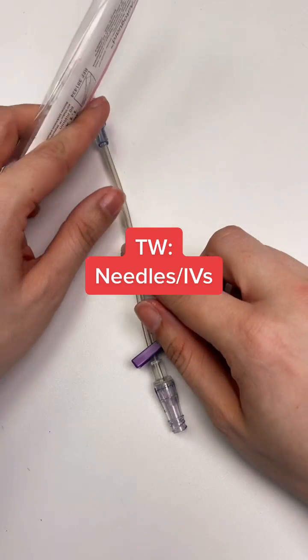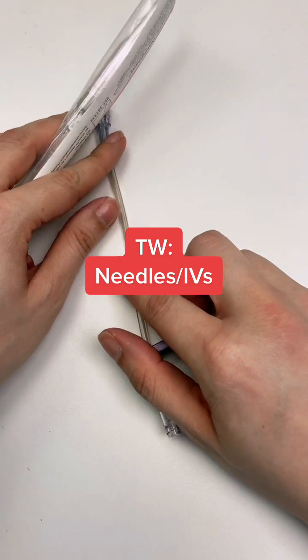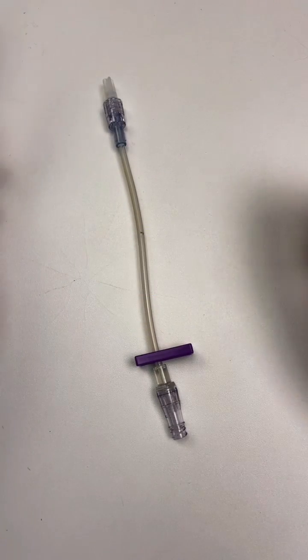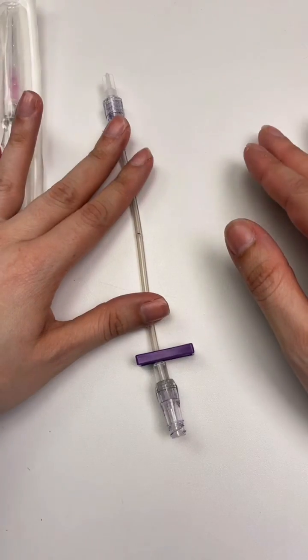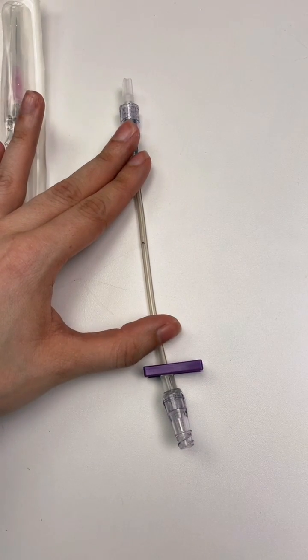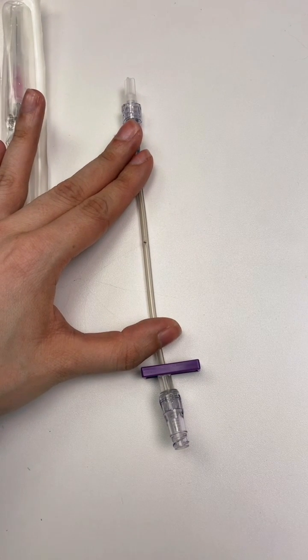In my last video I talked about how to start an IV and how to drop the angle once you get flashback. Something that a lot of people struggle with is actually advancing the catheter. I want to show you two ways that you can advance the catheter itself.